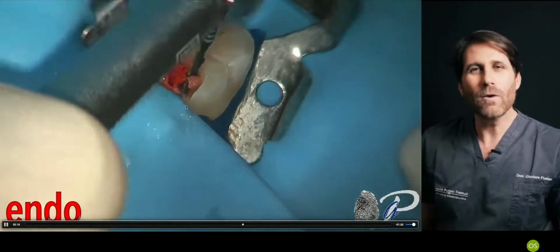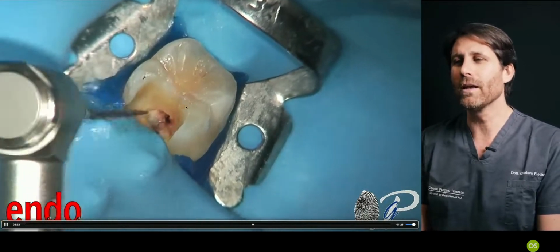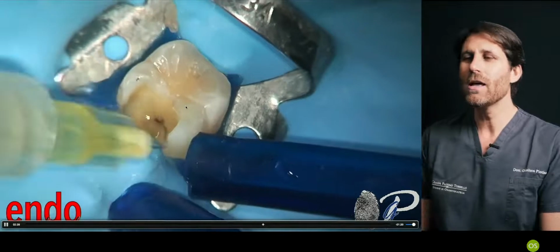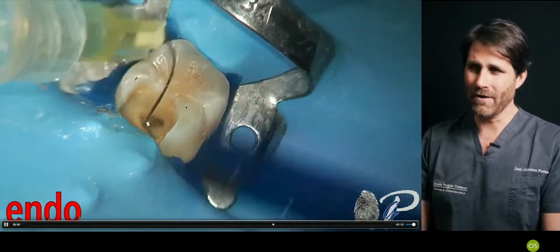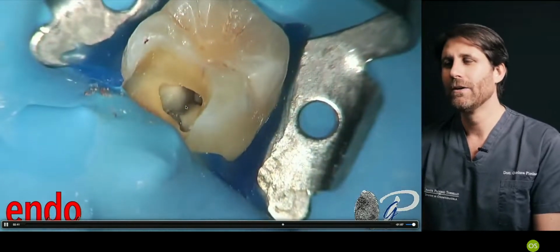So the dynamic way to open the access cavity means that we already start with the instrument during the access opening, when we still haven't opened the access cavity. Just to understand the orientation, in this case the main aim was to remove the coronal pulp to stop the bleeding and to have better visibility in our access cavity approach and for our subsequent procedures.